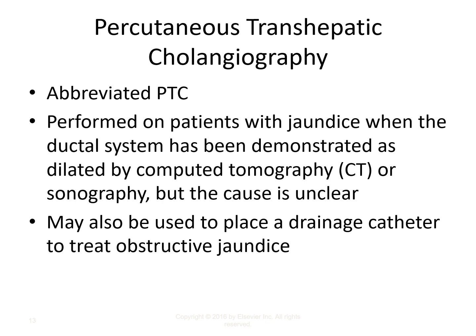Okay, your radiologist should have skill in placing that needle and advancing that needle into the correct location via either fluoro guidance, sonographic guidance, or CT guidance. There are some risks associated with that procedure.